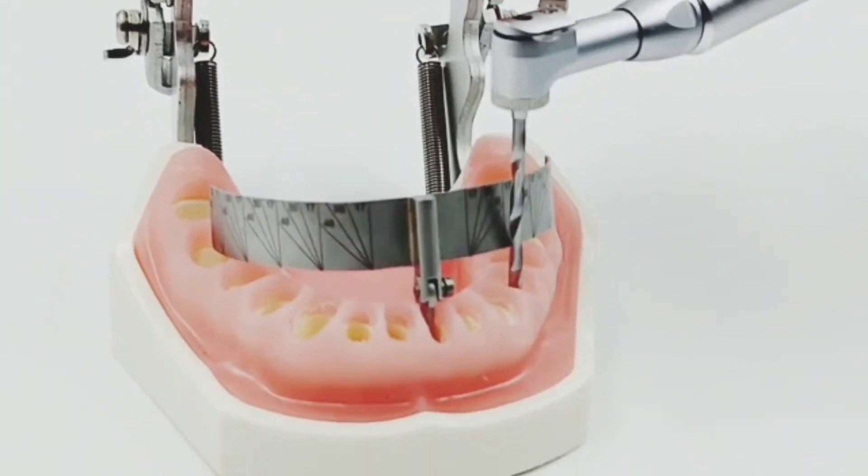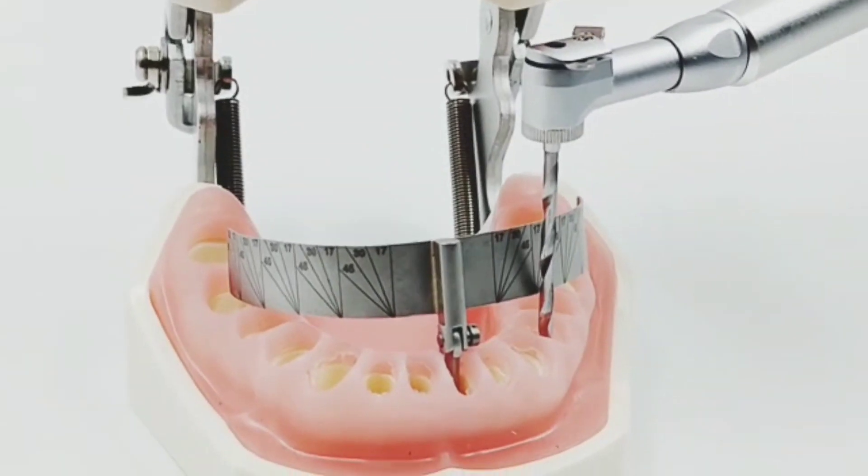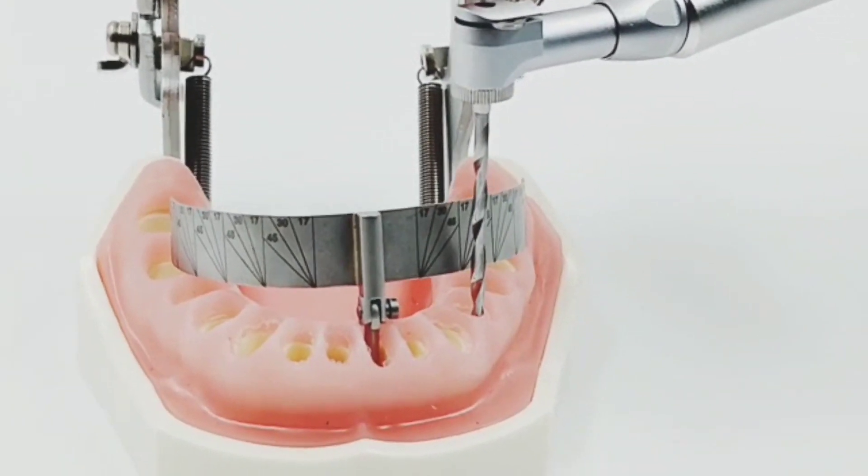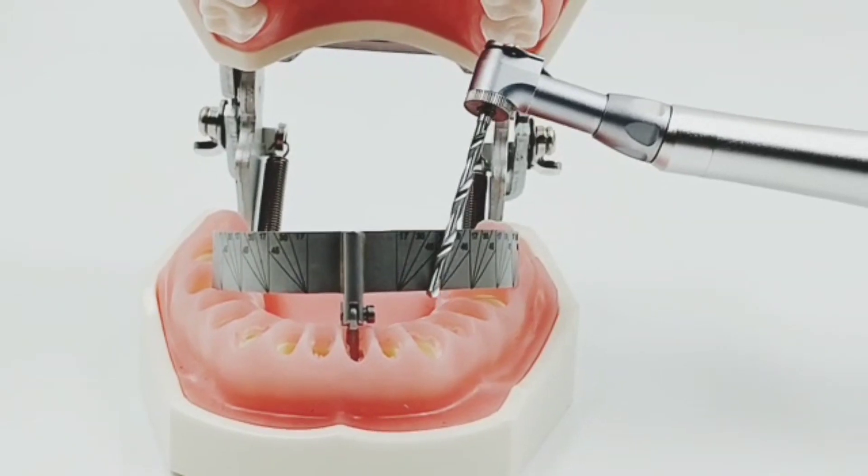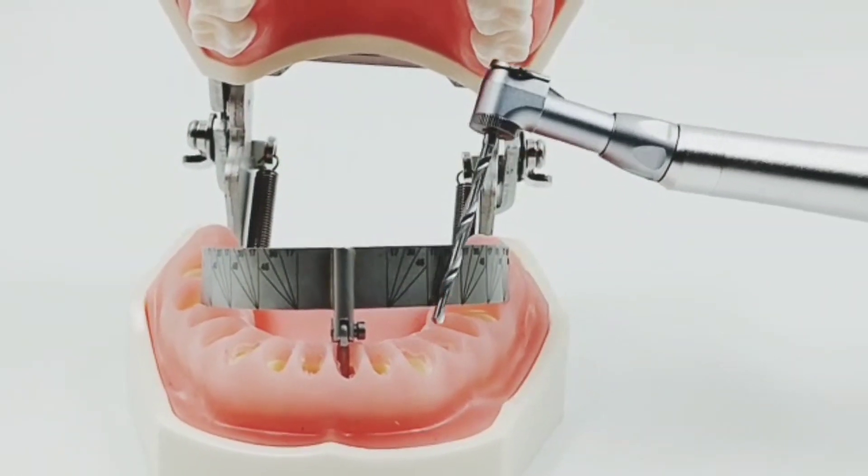It should not be greater than 45 degrees. Going with the drill from one corner to the other corner of the rectangle formed by two lines, an angulation of approximately 30 degrees is obtained.